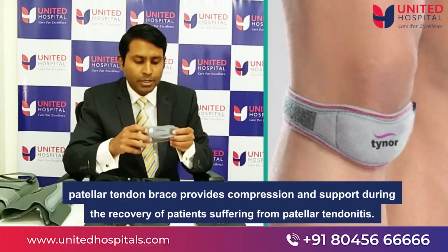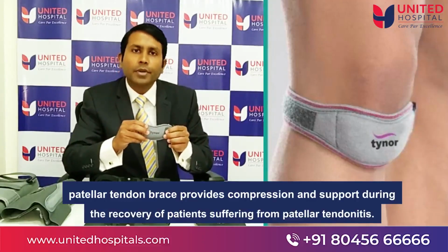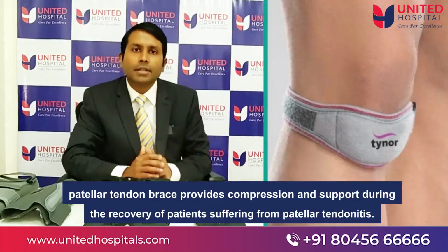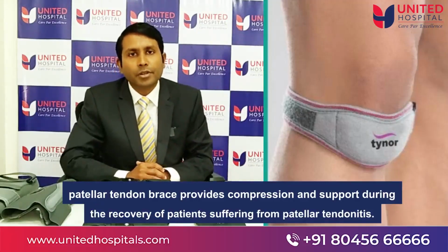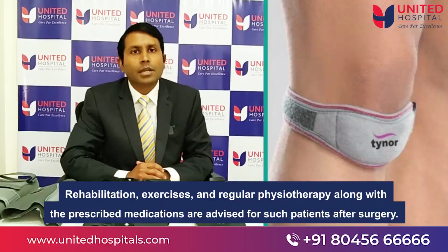And the other common band-like structure that you tend to see is referred to as the patellar tendon support. And again, this is used on top of the patellar tendon and provides compression and support when patients recover from the patellar tendinitis, which is quite often a painful condition, and they have to do rehabilitation exercises with the help of physiotherapy along with medications.